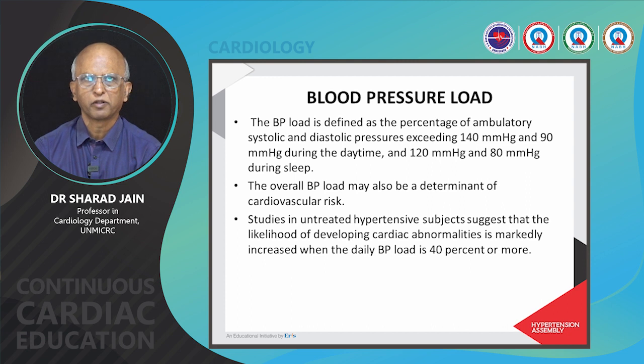Then, coming to the blood pressure load. BP load is defined as the percentage of ambulatory systolic and diastolic pressure readings exceeding 140 mm Hg and 90 mm Hg during the daytime and 120/80 during sleep time. The overall BP load may also be detrimental for cardiovascular events. Studies in untreated hypertensive subjects suggest that the likelihood of developing cardiac abnormalities is markedly increased when the daily BP load is 40% or more.